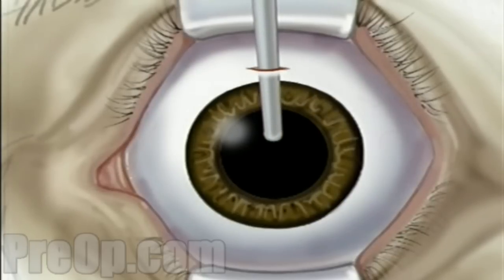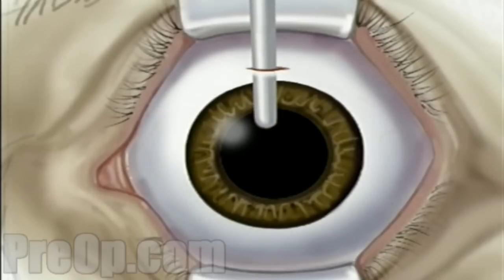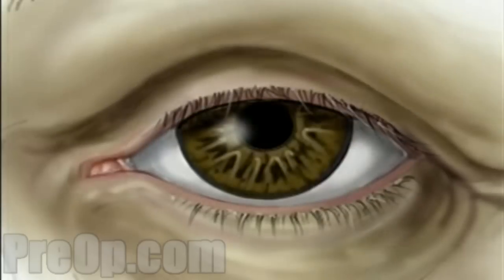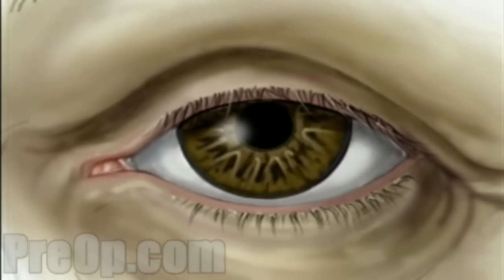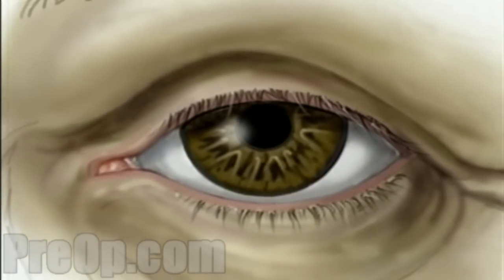Through the small incision, the surgeon will then insert the new lens. The lens is actually rolled up inside a special injector, designed to fit through the small incision made above the iris. With the tip of the injector inside the eye, the surgeon slowly injects the new lens where it unfolds into position. Because of the small size of the incision, often your surgeon will complete surgery without putting in any stitches.